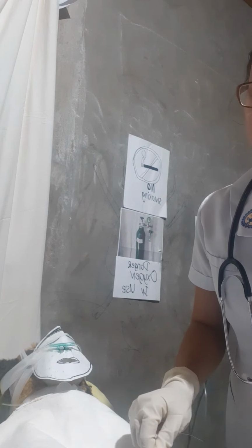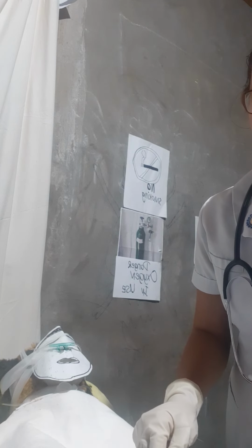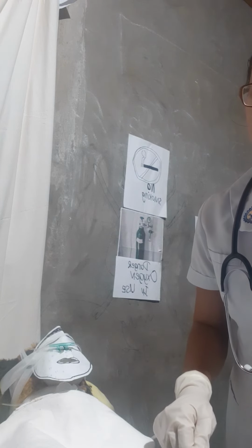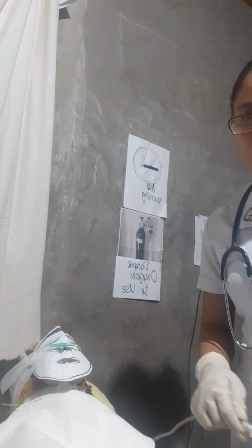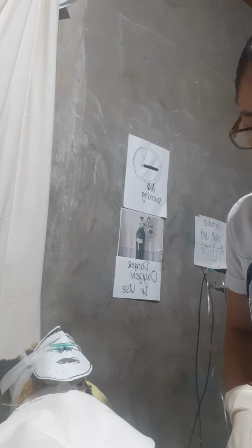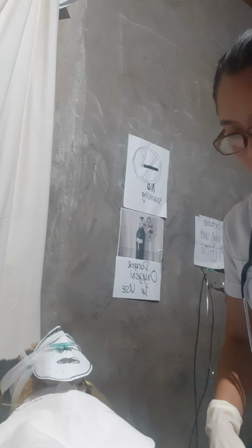Next, we need to make sure that the catheter is functioning. So we need to dip it into the sterile saline. Then test it.